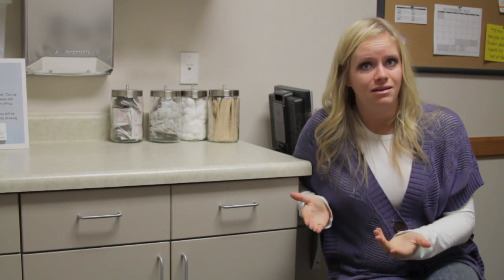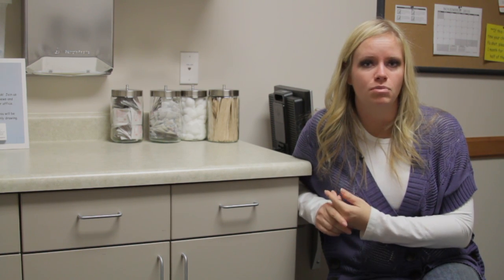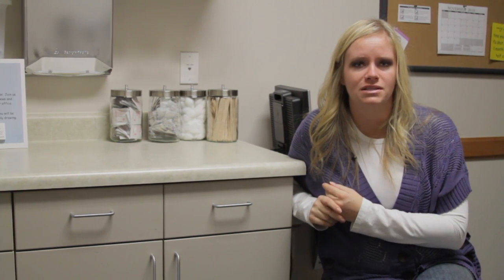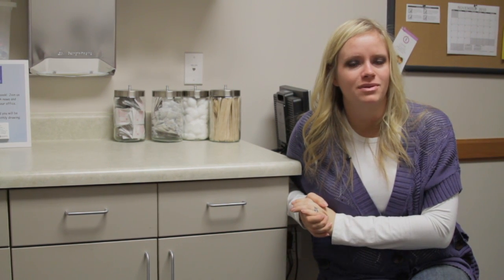If you ever feel like you can't feel your strings, you should visit with your provider so they can take a look and see if the strings are present. If not, then they would need to do an ultrasound and see if the uterus has sucked that IUD up a little bit, or if somehow it's been expelled without you knowing.